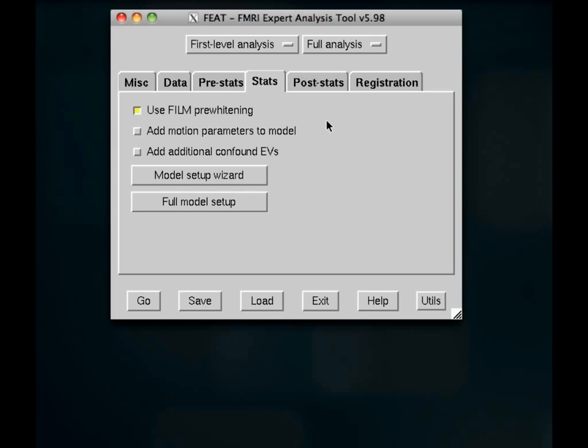First we're going to be covering these first three options here. Usually the defaults are fine. Film pre-whitening, you should leave that on. What it will do is it will try to account for any sort of auto-correlation present in your signal.